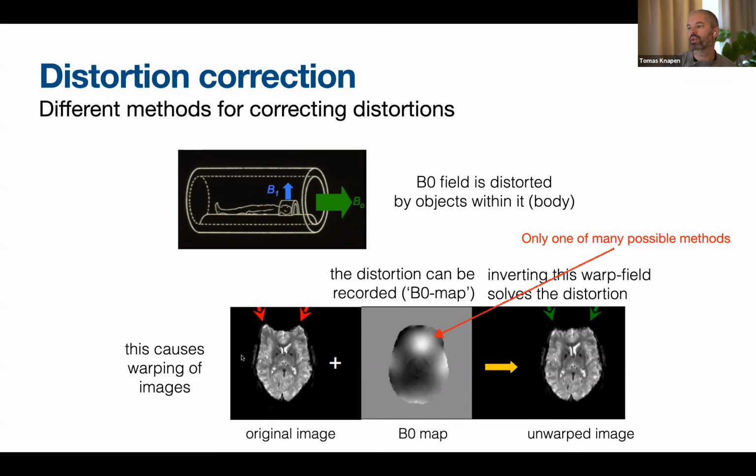Usually anatomical images aren't distorted at least this much. They're minimally distorted, and this makes the functional images and the anatomical images fit together, and that's what we want. Otherwise, you get activations outside the brain, for example, somewhere in front of someone's forehead, and that sort of thing is just impossible. We need to know where things are, and this is a necessary step.